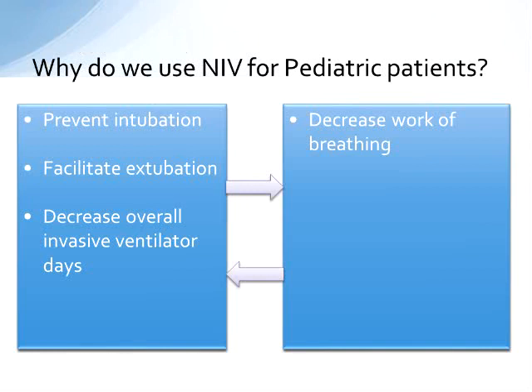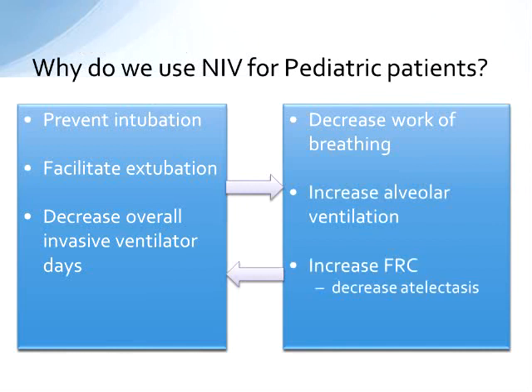It's been shown to improve vital signs, decrease heart rate, decrease respiratory rate. It increases alveolar ventilation by helping the patient achieve higher tidal volumes. It increases functional residual capacity with that PEEP or EPAP mechanism to decrease atelectasis in these patients, and can also be used to improve the effect or the significance of patients that have intrinsic PEEP due to chronic lung disease.